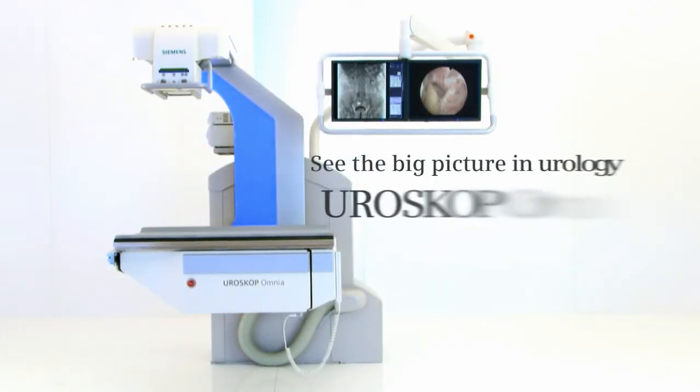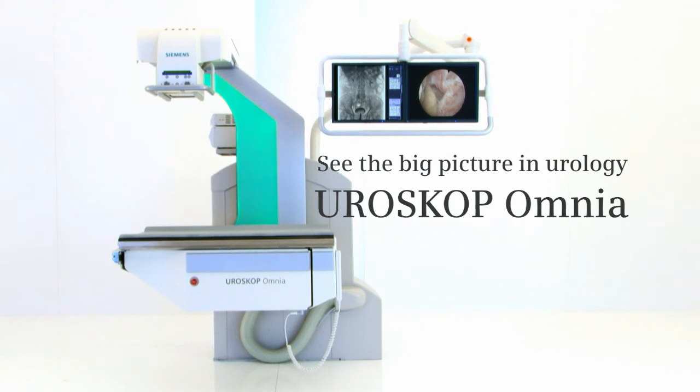Experience free patient access. See the big picture in urology. UROSKOP Omnia.